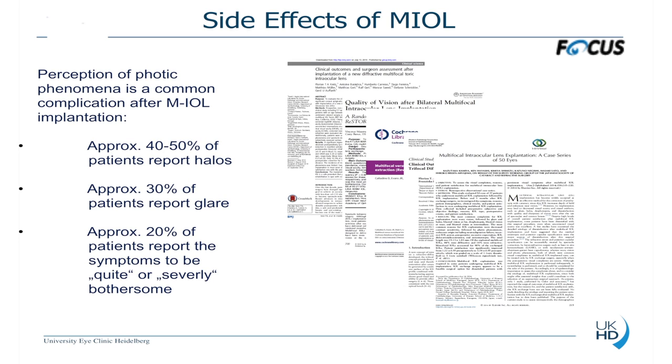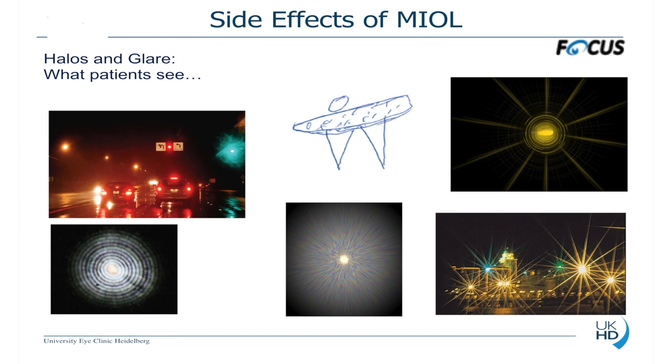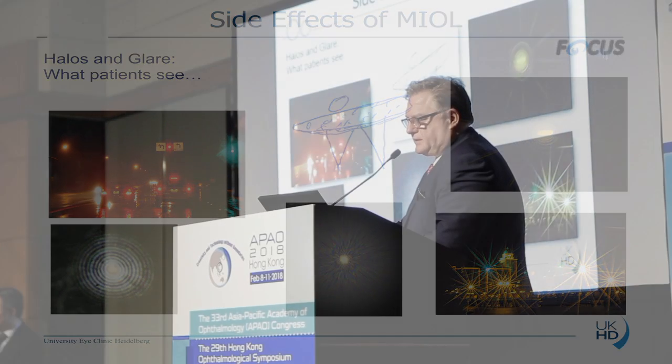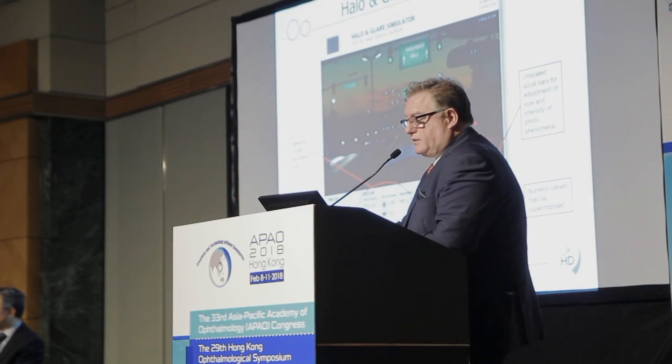The other aspect I want to talk about is the side effects, but I also want to look at some other factors here that we have heard already before. We know that with the other multifocal lens technologies, really a big number of patients suffer from this. And a lot of times patients come to you and they show you funny drawings, how they perceive these things, or they try to make a photo and show to you how it looks like. And you have already heard about that.